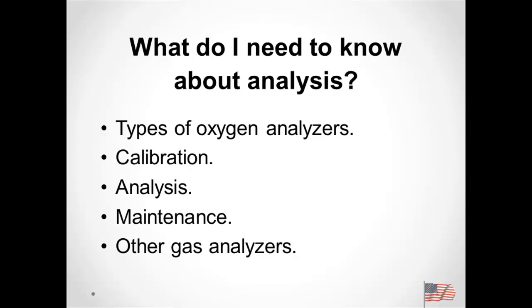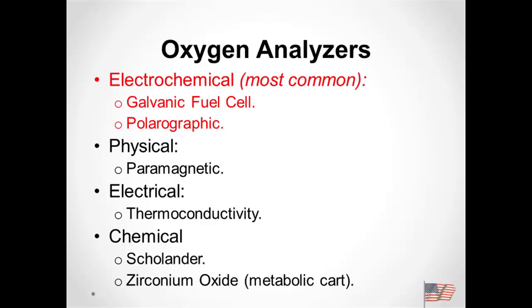So what do we need to know about this process? We're going to talk about the different types. We'll talk about how we get to the calibration process, how often we analyze, do maintenance on them, and some other gas analyzers. There's multiple different types of oxygen analyzers.